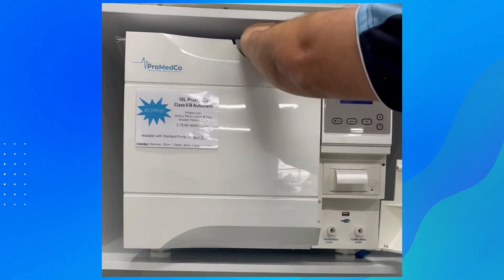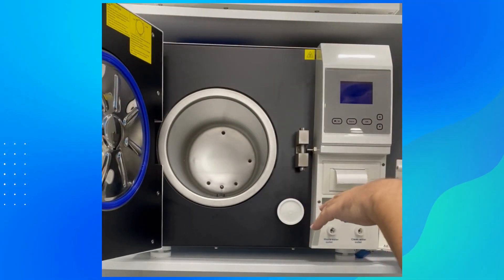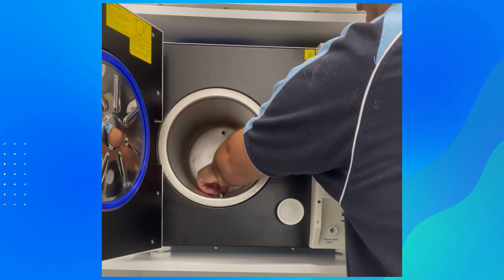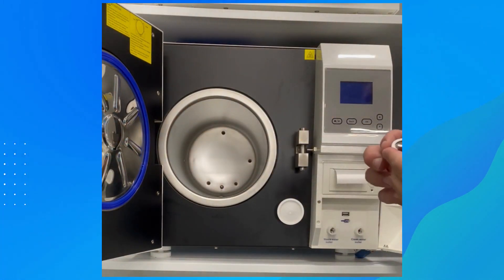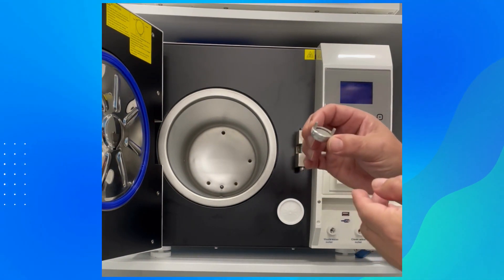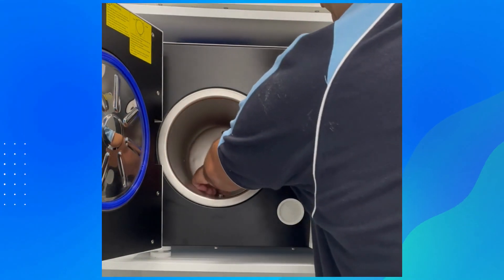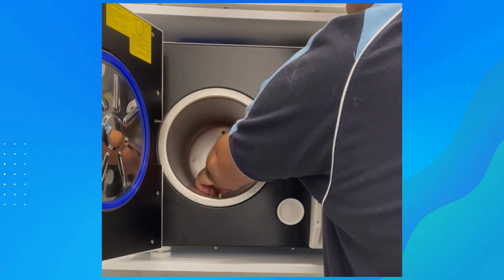Once drained, twist the tool back to the right and remove it. Another step required once a week is to check inside the machine. Remove the trays and check the drain filter at the back. There's a butterfly-type connection that unscrews to the left — take it out and you'll see a mesh that stops paper or debris from reaching the valves. Clean it by rinsing under cold water with a light scrub if needed, then put it back in and screw to the right.